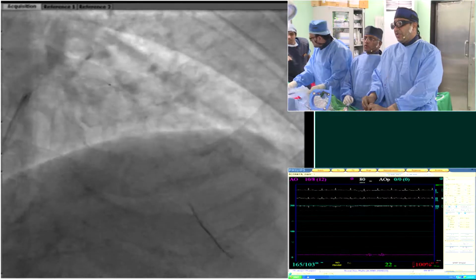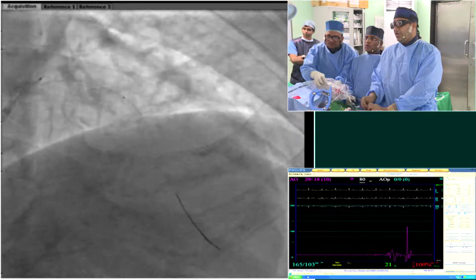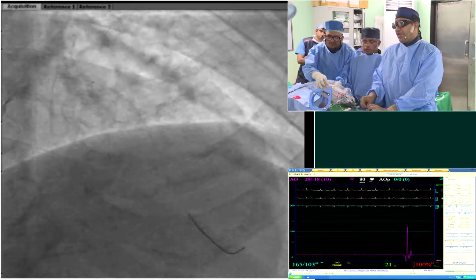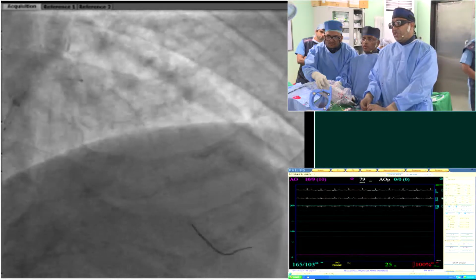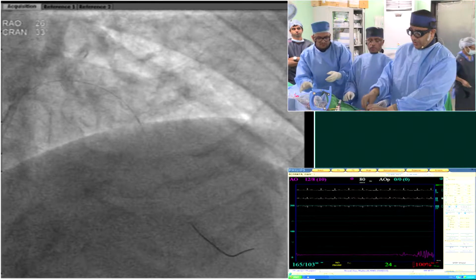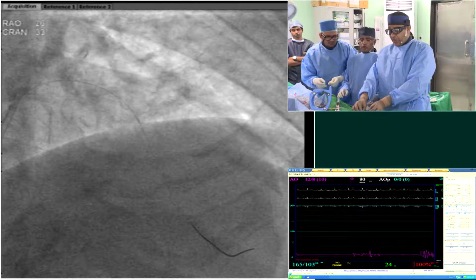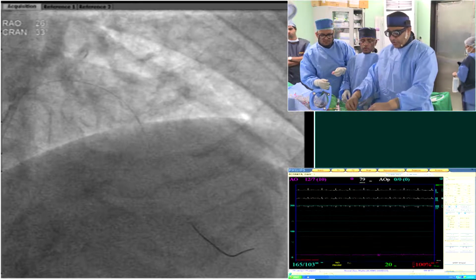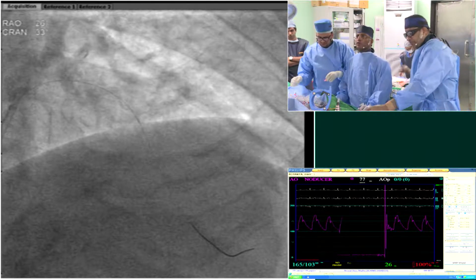Now you see the OCT still struggles to go in. Can you see that? Yes, we can see that. Yes, and this is despite a 1.5 rotational atherectomy. So now what do you think? Should we put a stiffer wire through a microcatheter and then try the OCT, or stent it and then do the OCT? Try that, or maybe a small balloon inflation. Okay, after the rota we can do that. We'll probably pre-dilate and do OCT, size the vessel and then stent. Okay, let me try the pre-dilatation. We'll take a 2.5 balloon, or we can take a 3 directly.